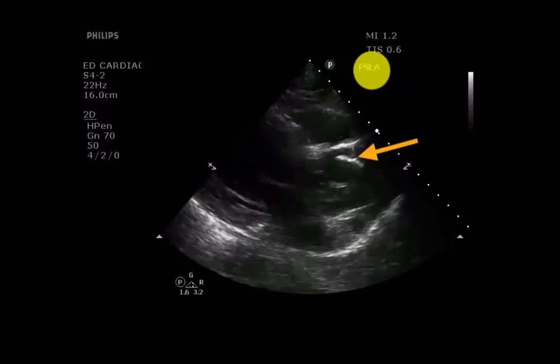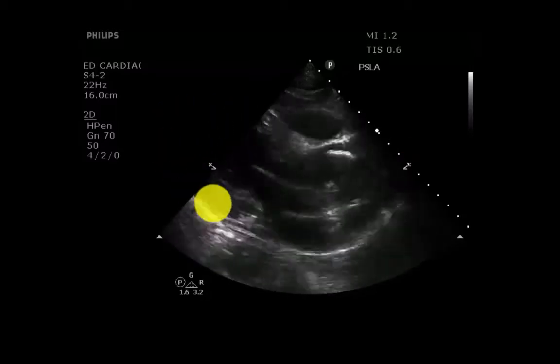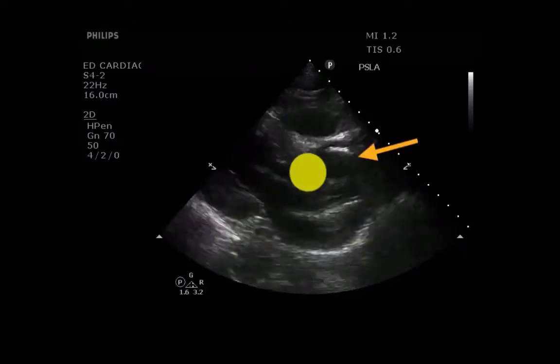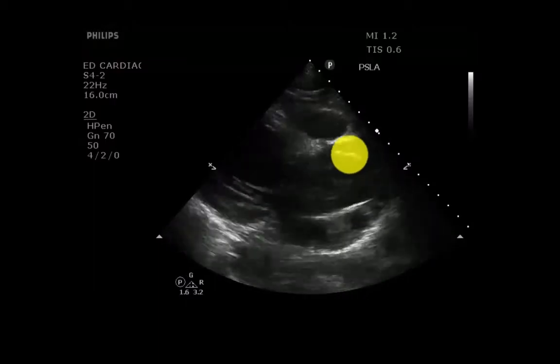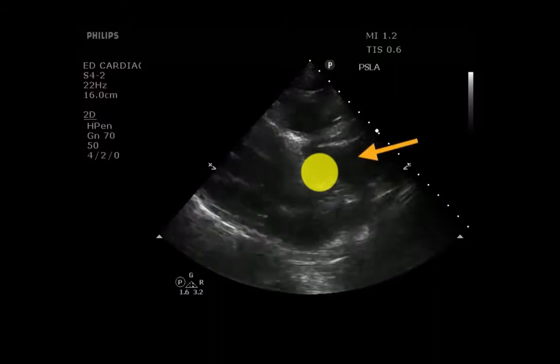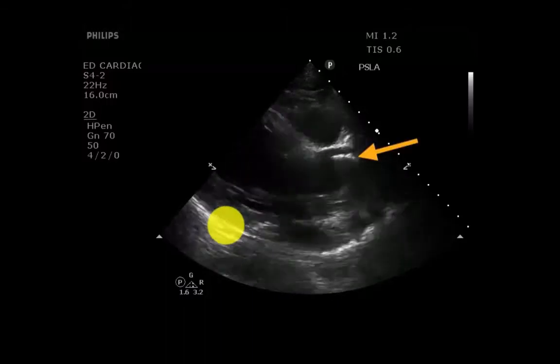This is a parasternal long axis view. So to march through this, you've got right ventricular outflow tract, you've got your left ventricular myocardium here. This is actually descending thoracic aorta right there. You can see the left atrium, mitral valve. Right here is the aortic valve complex, and you can see this mobile flap is moving back and forth. This also looks really big. My suspicion is that she's got dilation of her aortic root, which you see not uncommonly in patients with aortic dissection. Notably, there's no substantial pericardial effusion here, which is one of the things we talked about earlier.